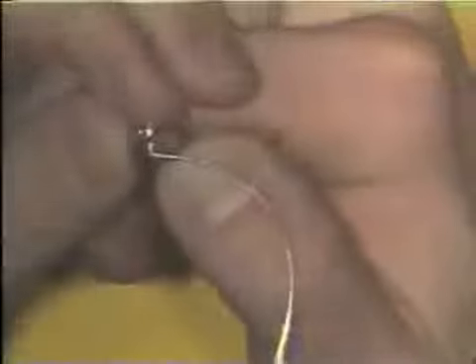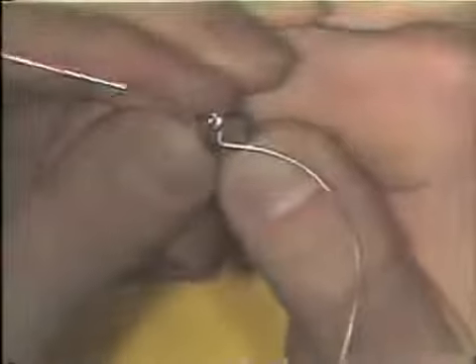The wire is placed in the beaks of the plier about 1/2 of the way, or maybe slightly more than half of the way back on the round beak of the plier. It is oriented correctly, and with the thumb or the finger, the curve is started around the loop.